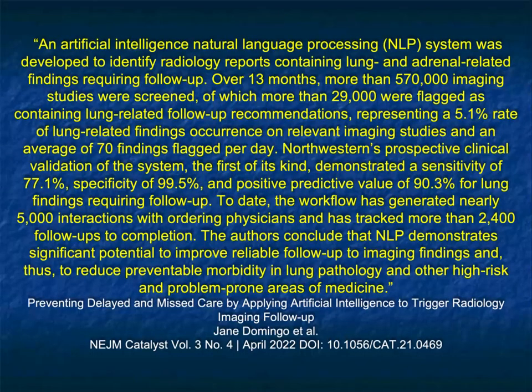So again, you can see now we're using radiology as the front end. The films are read, but maybe I recommend a follow-up and it's not done. In this article from Northwestern, all of the follow-ups were done with a sensitivity of 77% and a specificity of 99%, positive predictive value of 90+% for lung findings requiring follow-up.